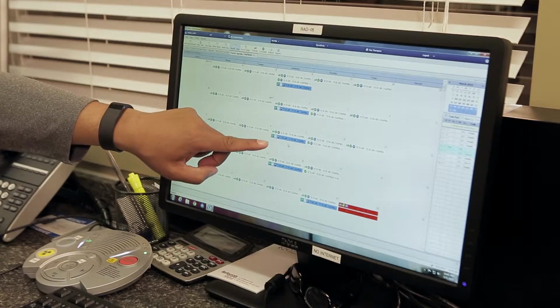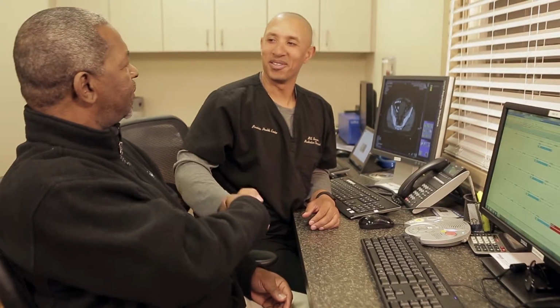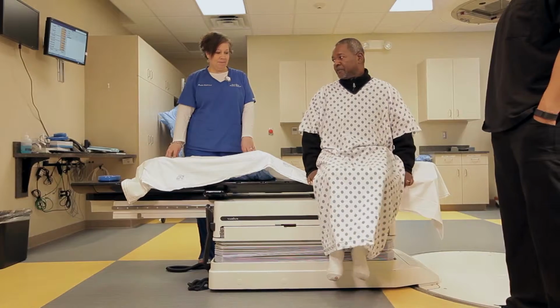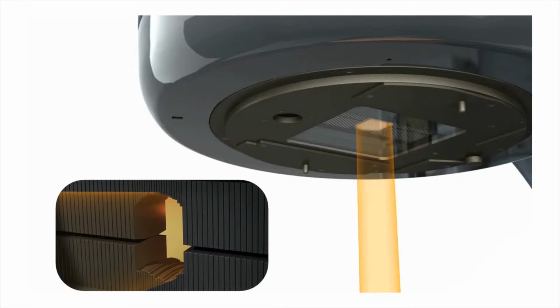At the end of this appointment, you and your radiation therapist will create a treatment schedule that will accommodate your needs as best as possible. Your next visit will be your first radiation treatment, typically 3 to 5 business days later. Radiation therapy focuses on the target site, using high-intensity X-ray energy on the cancer, treating as little healthy tissue as possible. Advancements in radiation treatments are more accurate than ever before, resulting in better patient outcomes due to increased precision.